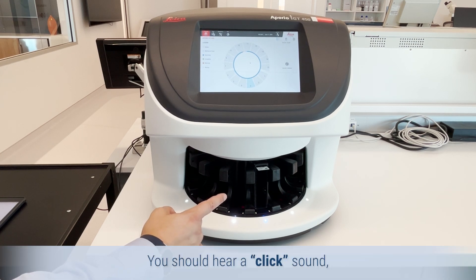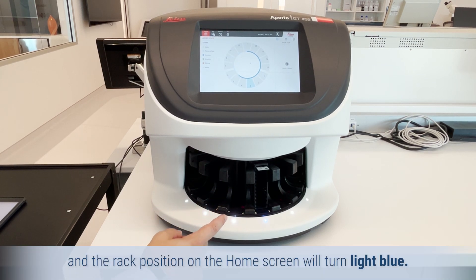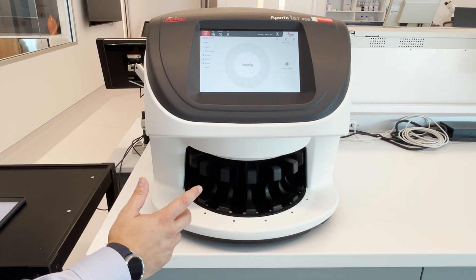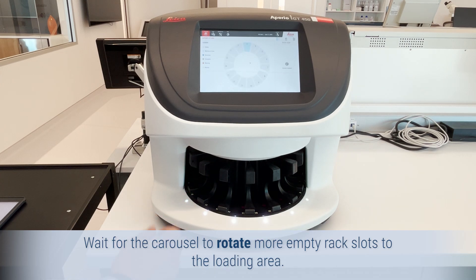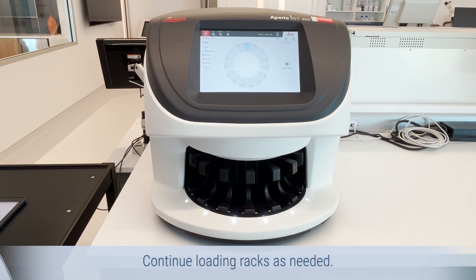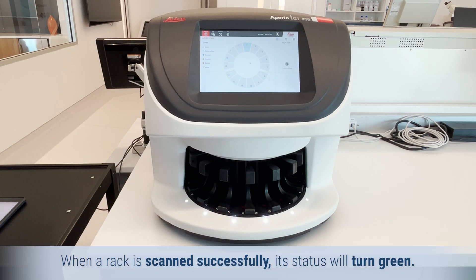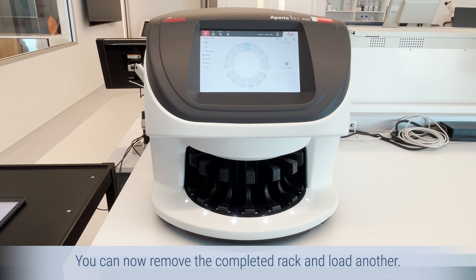You should hear a click sound and the rack position on the home screen will turn light blue. Continue loading racks until you fill the front six rack slots. Wait for the carousel to rotate more empty rack slots to the loading area, then continue loading racks as needed. When a rack is scanned successfully, its status will turn green. You can now remove the completed rack and load another.